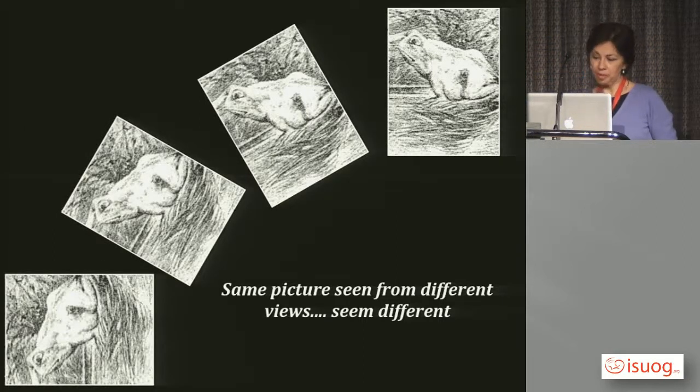You sure it's a frog? Looks more like a horse now, doesn't it? So scanning is, it is an interpretation. There are lots. Calm down. I want to finish my lecture.